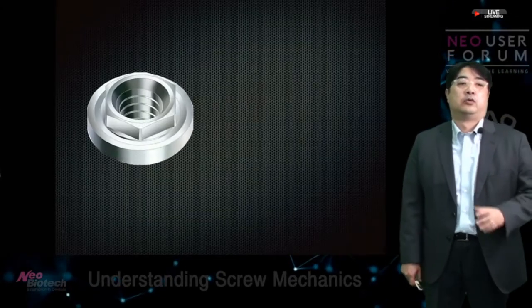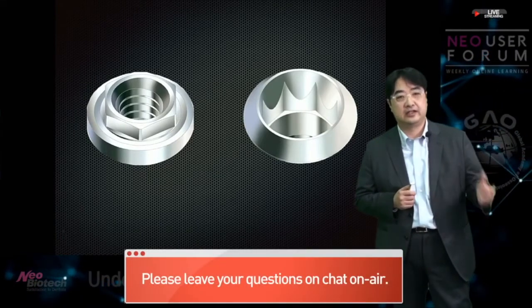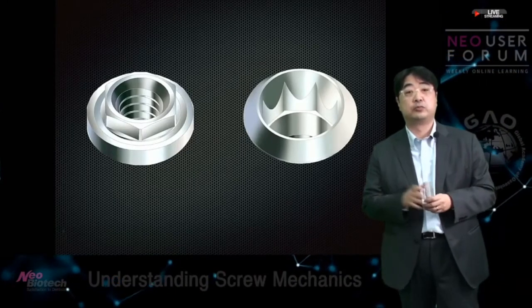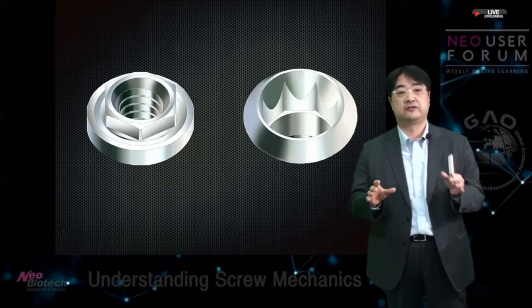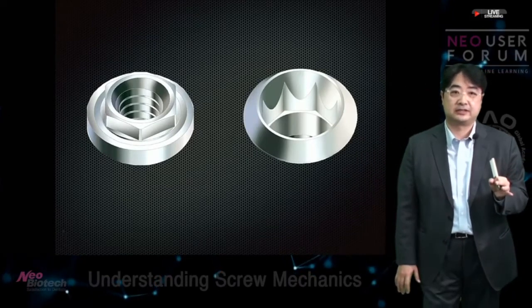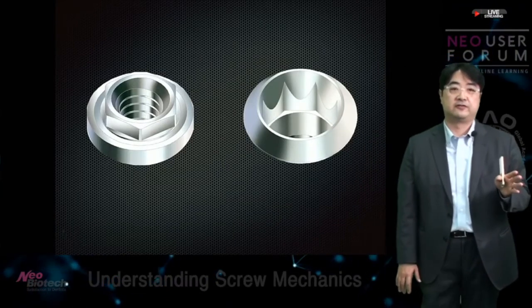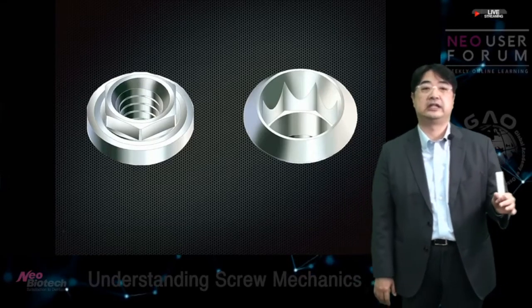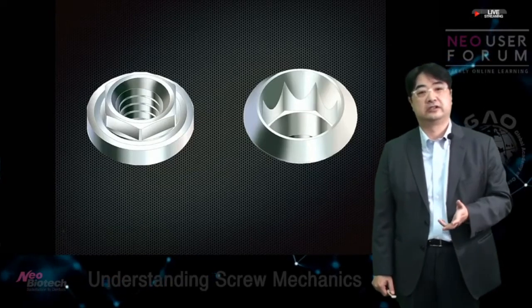Okay? Well, what kind of implant are you using? Easily we divide them into external or internal, right? But by the way, I don't like that classification. I think it's better to divide implants into friction fit or non-friction fit connections. Most external implants are non-friction fit connections, and most internal implants are friction fit implants. By the way, some of the externals are not non-friction, and some of the internals are not friction, right? But anyway, I'm going to divide them into external and internal today, okay?